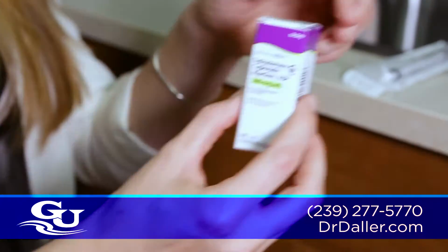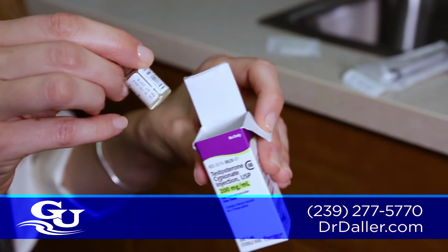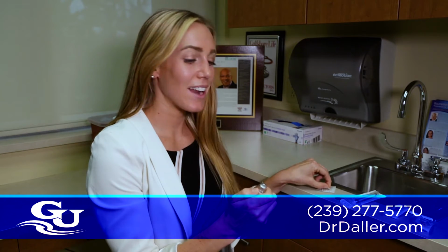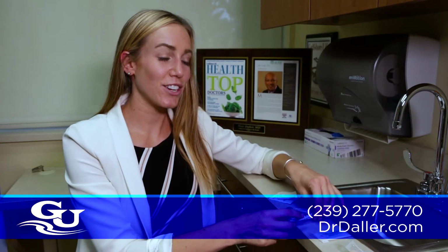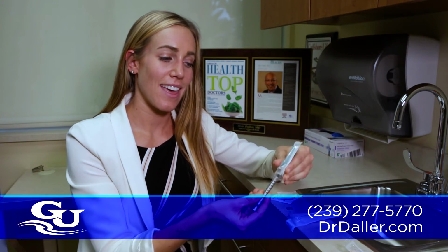So next, open your vial of testosterone. Remove the cap from your vial and clean the top of your vial with an alcohol prep pad. Take your syringe and attach it to your 18 gauge needle by twisting. Then you're going to prime your syringe just like this.